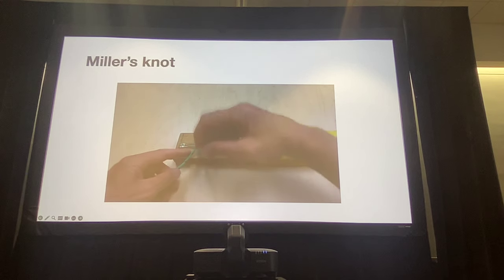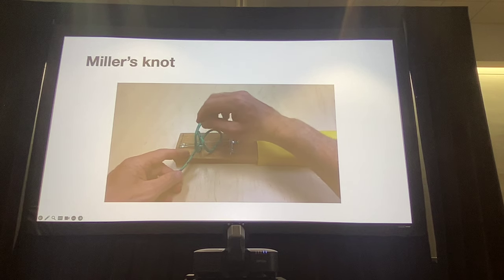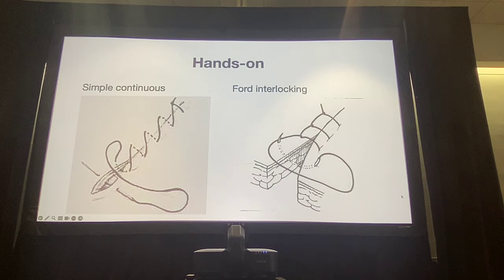Any questions so far about any of this that we've covered, any questions about surgery in general? It might be a good time, for as much time as we want, to practice what you've learned so far. The continuous patterns are a good way of combining everything you've learned from the surgeon's knot, square knot, and then whatever continuous pattern you want to practice more of, and then how to end the suture line. I can always go back to the slides for those who want it, the mattress suture patterns, both horizontal and vertical, those are really useful too. But in my mind, if you can at least master surgeon's knot, square knot, and then a continuous pattern, that takes care of most cases. Over time you'll pick and choose what you like and what works in certain areas of the body. But feel free to practice all of these and see what you think.